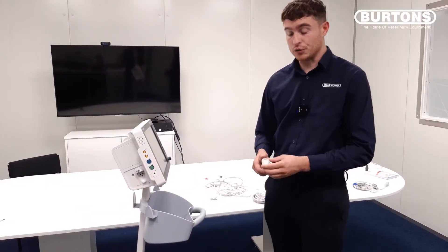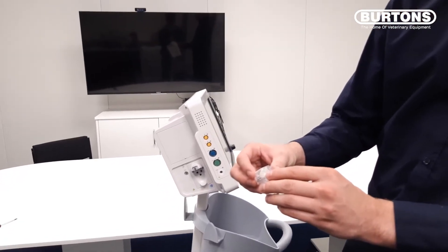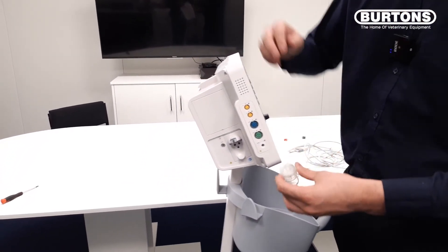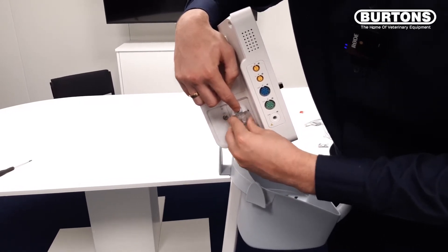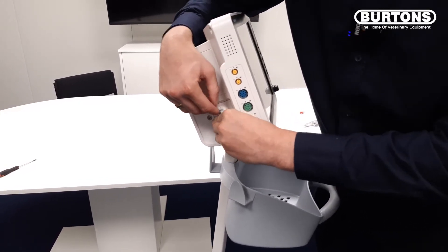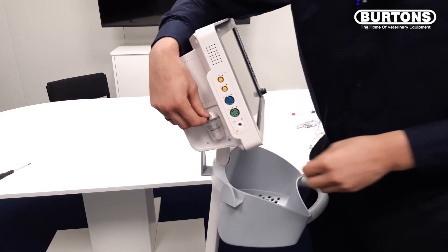I'm now going to show you how to attach the moisture trap. You will see there are two holes on the back. To attach it, we just lift up the grey clip and slot on like that. The grey clip will then secure that in place.